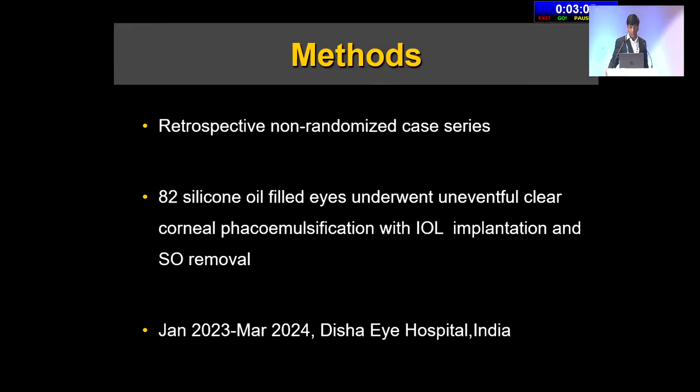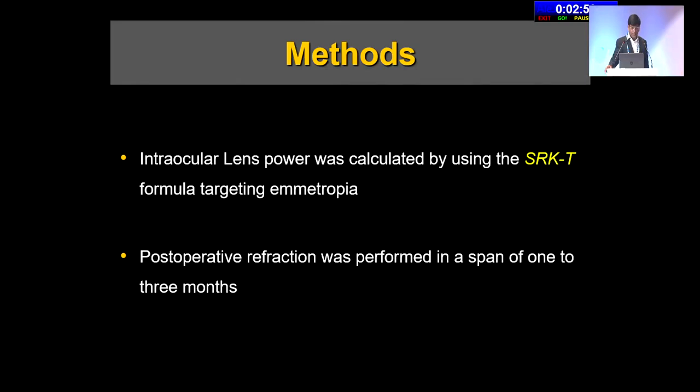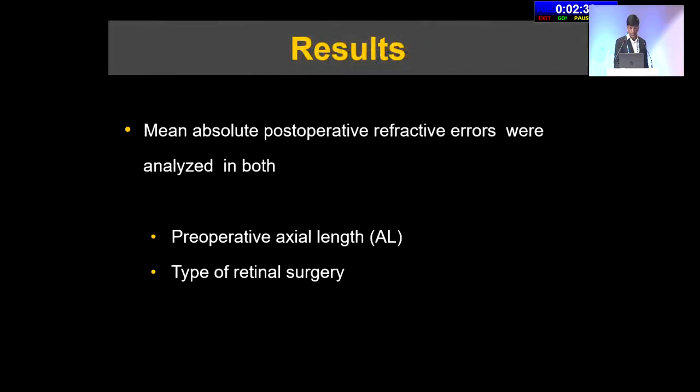It was a retrospective non-randomized case series where 82 silicon filled eyes underwent uneventful clear corneal phacoemulsification with IOL implantation and silicon oil removal. The study was conducted between January 2023 and March 2024 in Disha Hospital, India. The intraocular lens power was calculated using the SRK/T formula targeting emmetropia. The post-operative refraction was performed in a span of 1 to 3 months. The mean absolute post-operative refractive error was analyzed both in terms of the preoperative axial length and the type of retinal surgery.